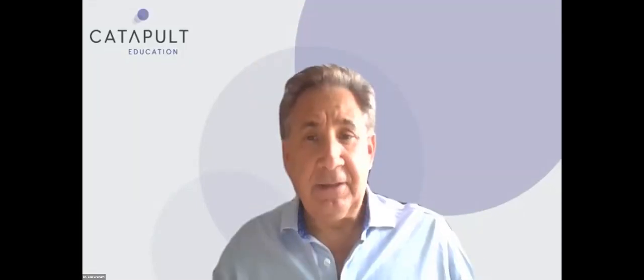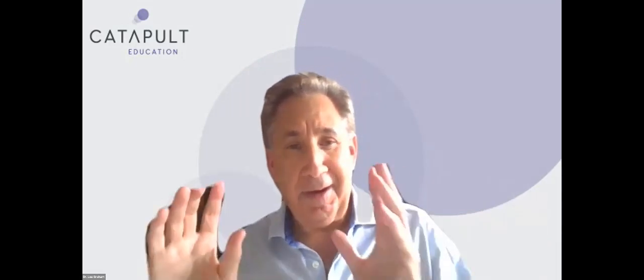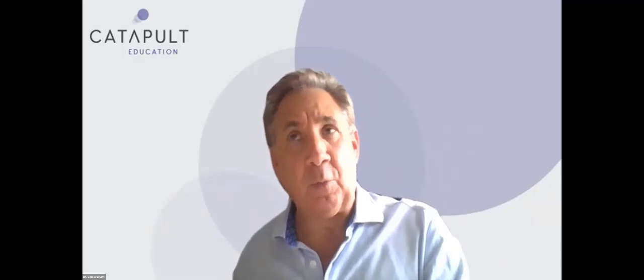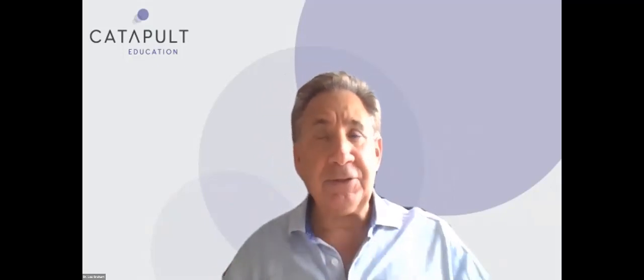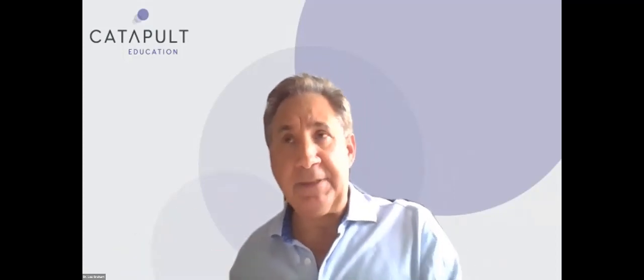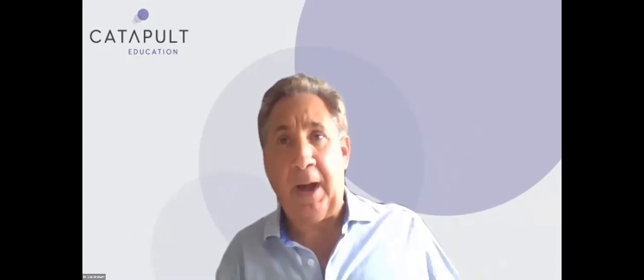There's a lot of different variables that come along with an aesthetic restoration, so I'm trying to cover as much as I can. And Mark Latta, the dean at Creighton, who's a personal friend of mine, said, and we have to be careful here, what we recommend. Personally, in my experience with Activa, and what Mark comments, it's really more of a resin that I bond in.